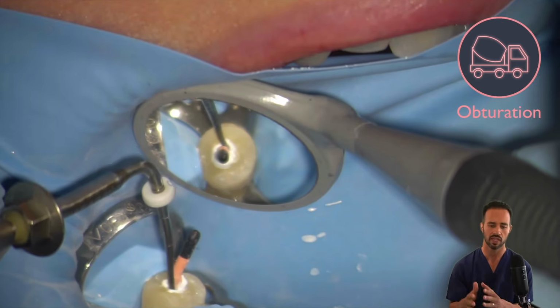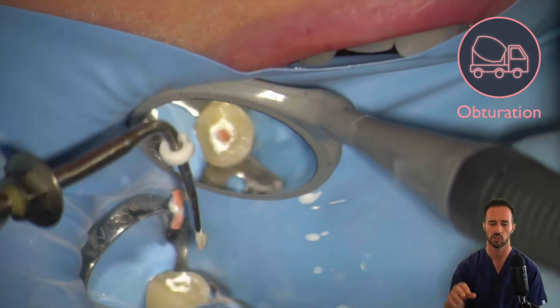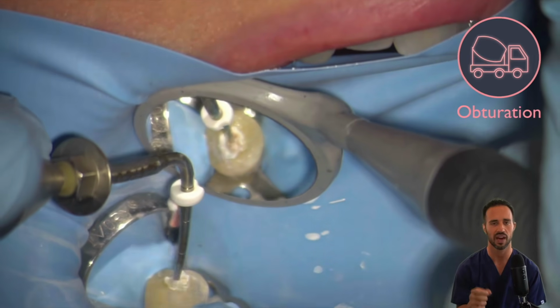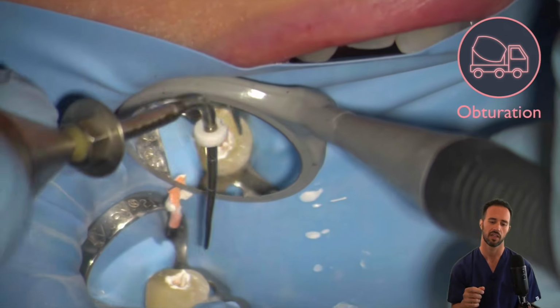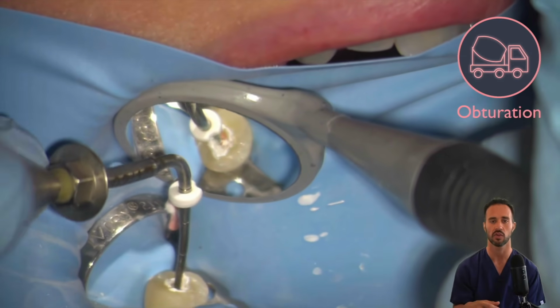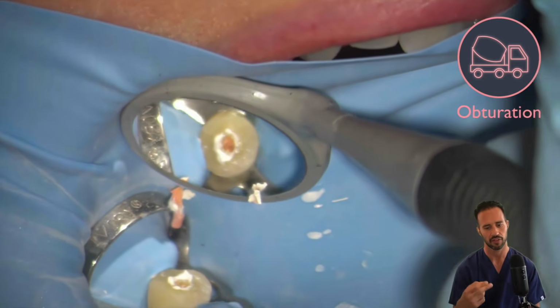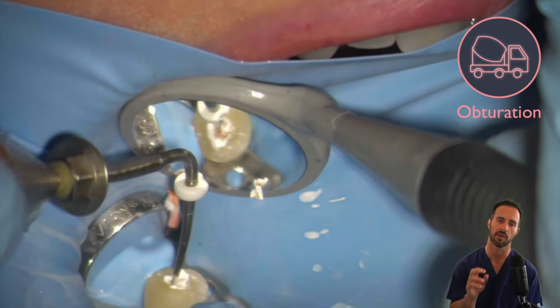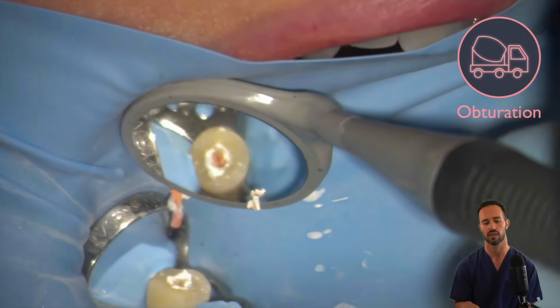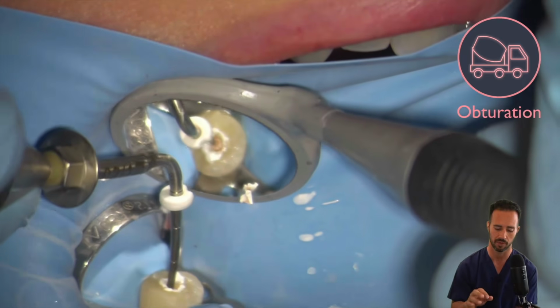And so now we're using our System B 08 tip to sear off the gutta percha right at the orifice. Again, this is a form of obturation known as hydraulic condensation, and we're going to go ahead and sever that off at the orifice, and then start our compaction of gutta percha with our size 1 Buchanan hand plugger.